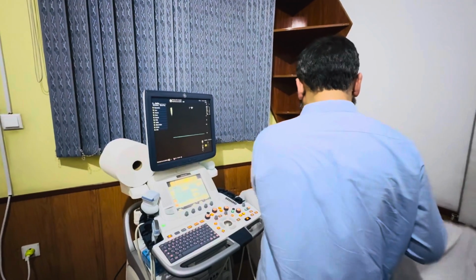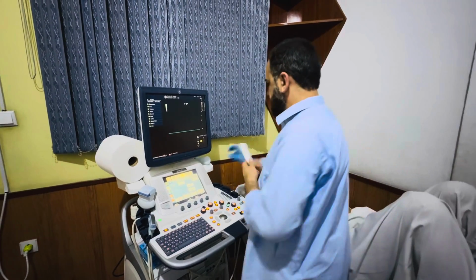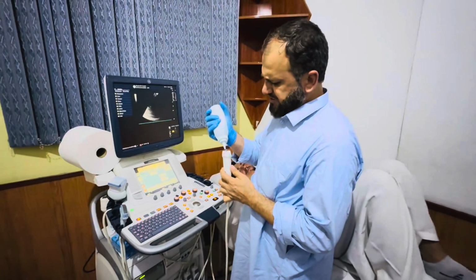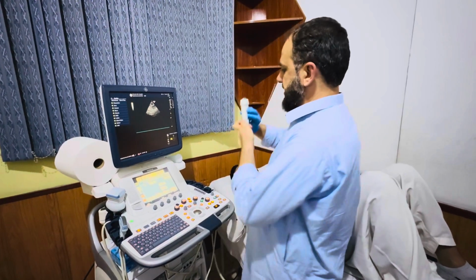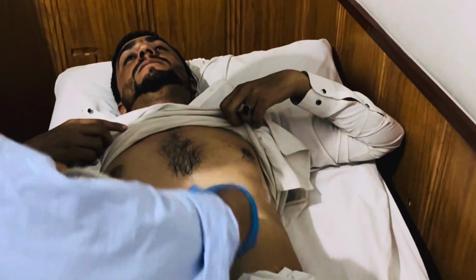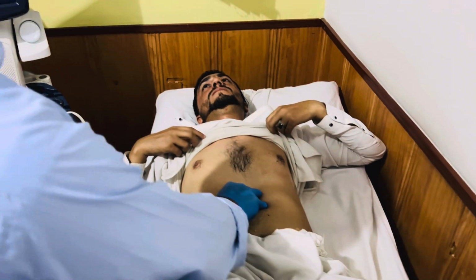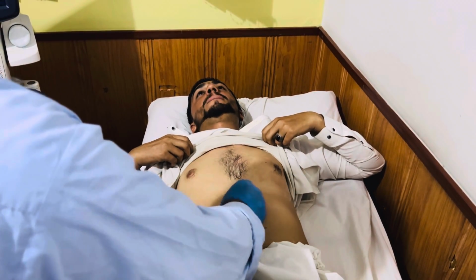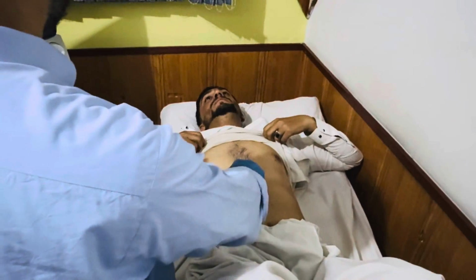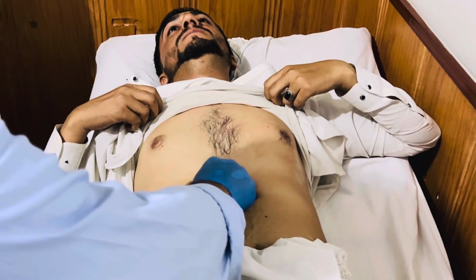Okay, I will tell my patient to lie down straight, yes, and bend your knees. No, bend it, perfect. And again, the notch of the transducer where you can see the light is on, that will be towards the 3 o'clock. So look at here. I have my camera in here. So you can see this is the subcostal area, and you just push a little bit and tell the patient to breathe in. Breathe in and hold it. Hold it. Let's see. So I'll make it a little bit brighter.